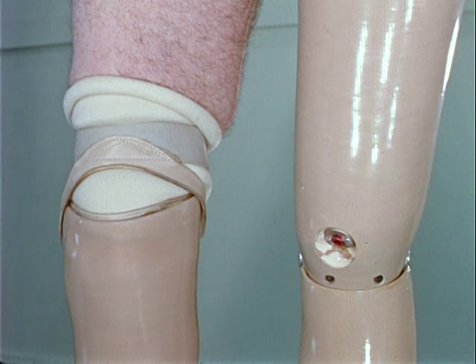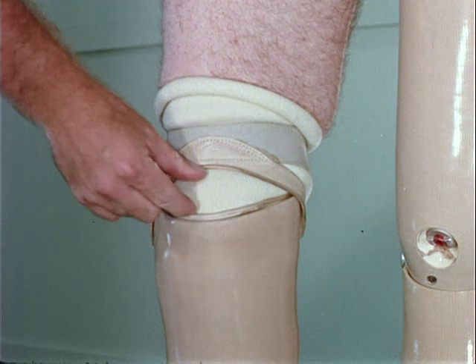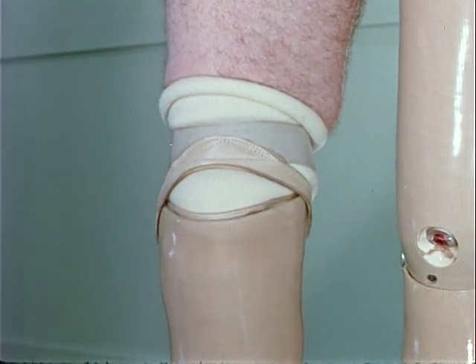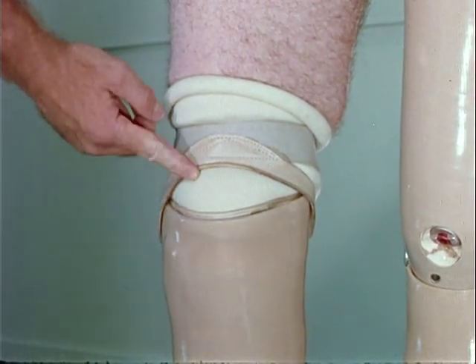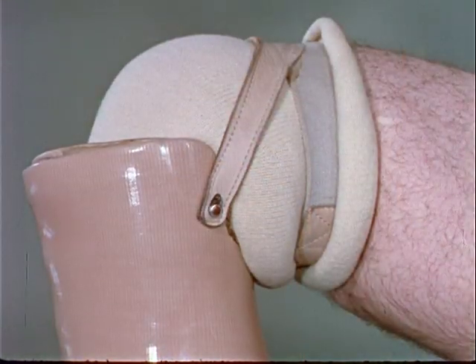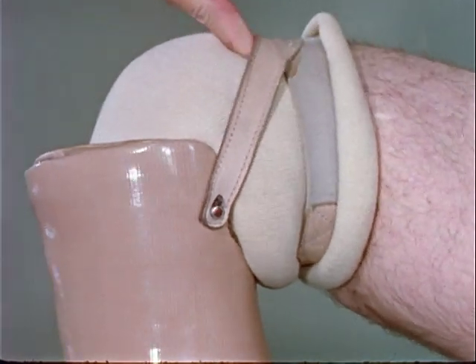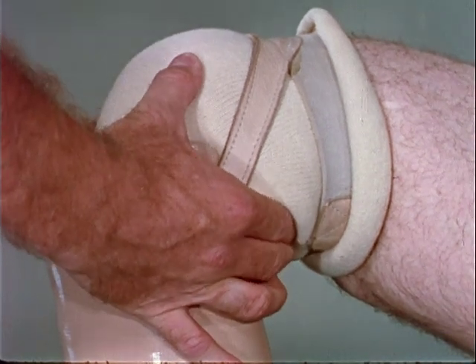The tuberosity of the ischium should ride on the ischial seat. The anterior brim of the above-the-knee prosthesis should not contact the anterior superior spine of the ilium in forward bending of the trunk. The upper brim of the patellar tendon-bearing prosthesis bisects the patella, utilizing the cuff suspension to help maintain the knee in flexion and to suspend the prosthesis itself. The cuff suspension should be taut in standing and relaxed when sitting. Choking of the below-the-knee stump occurs if the posterior wall of the prosthesis is too high.